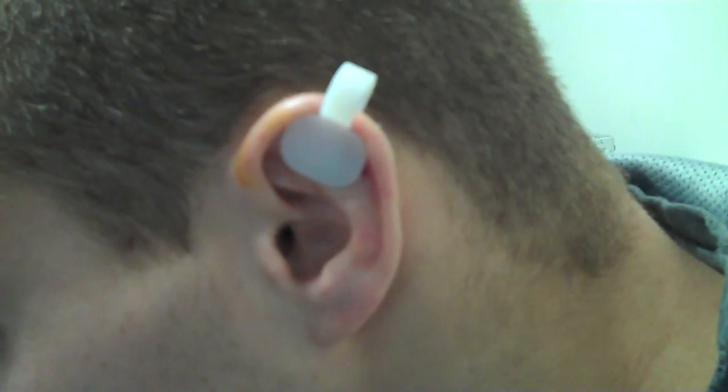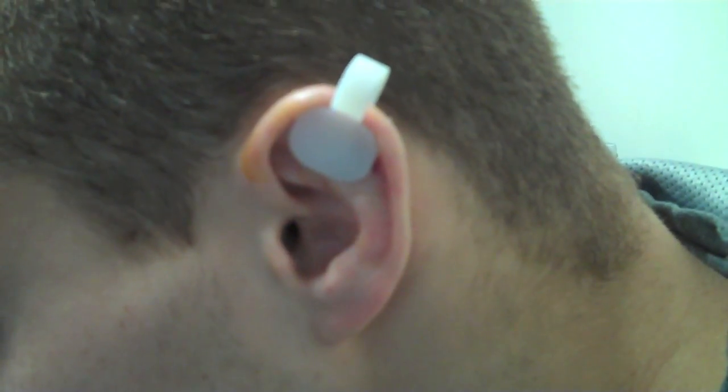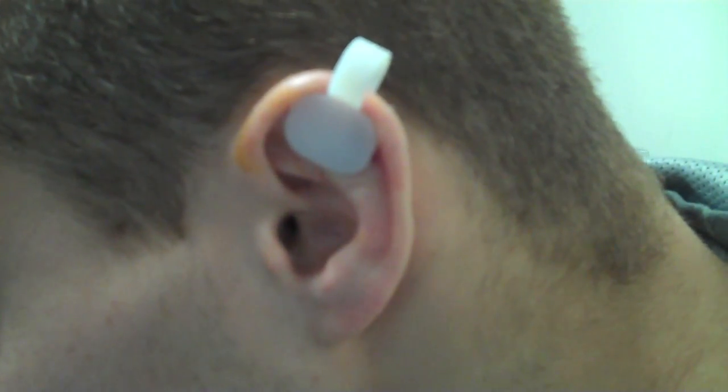After the initial cast comes off, this is a clip that could be worn at night to protect the ear from having a recurrence of the hematoma.